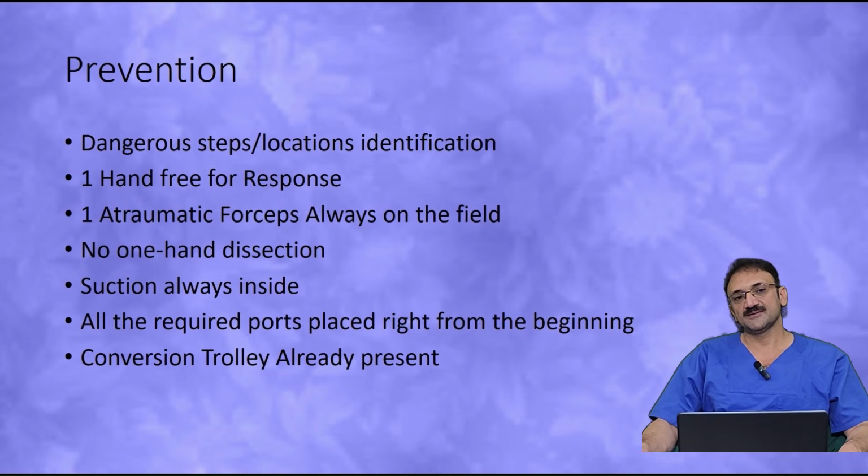So that can be a really cumbersome situation, because it is in the angle. Then you can just hold it, but you can't apply a clip, you can't apply a stapling device, and of course you have to repair it. So that is a dangerous location.